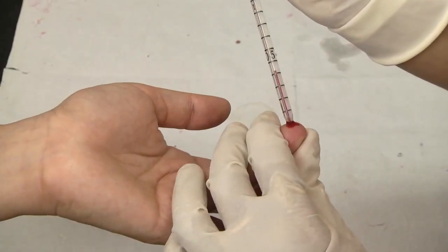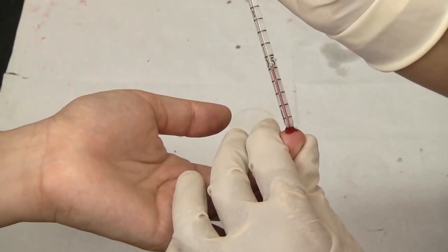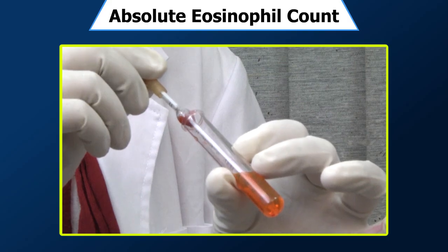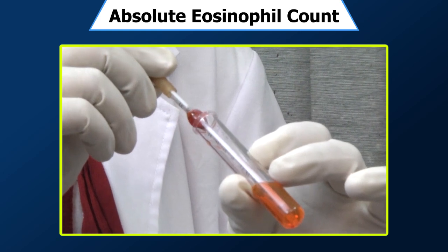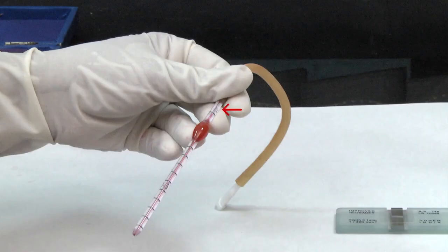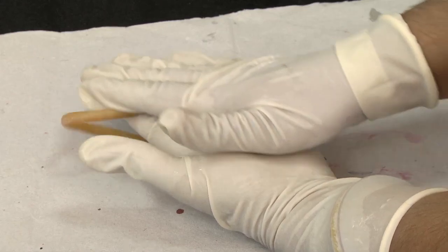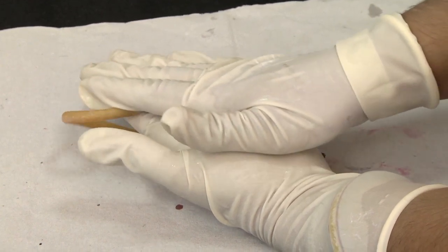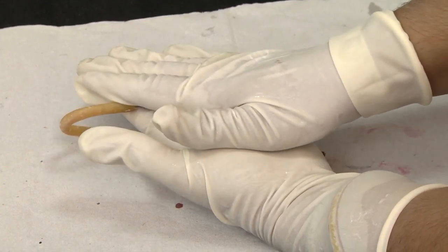Aspirate the second drop of blood into the WBC pipette exactly up to the 0.5 mark, and dilute it with diluting fluid by aspirating up to the 11 mark. This gives a dilution of 1 in 20. Gently rotate the pipette for at least 3-4 minutes in the palm of the hand to ensure proper mixing of blood and fluid.